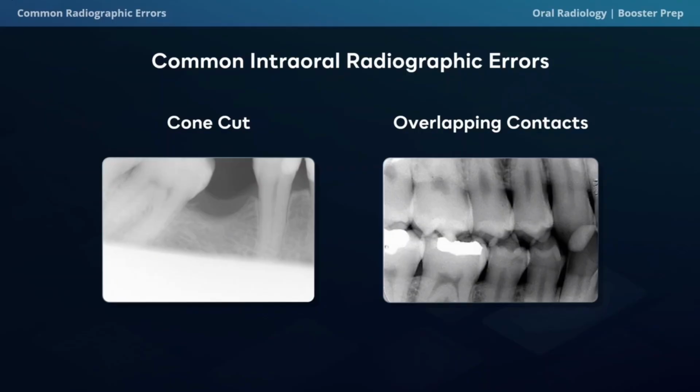So students, if you look closely at the image on the right, can you spot anything else that may look a little odd on the radiograph? So one thing that I like to point out is that the teeth are in occlusion, and ideally we want them slightly separated and the patient not biting down really hard on the sensor, because with that little bit of space, it helps us to capture the interproximal areas and the occlusal areas very clearly.